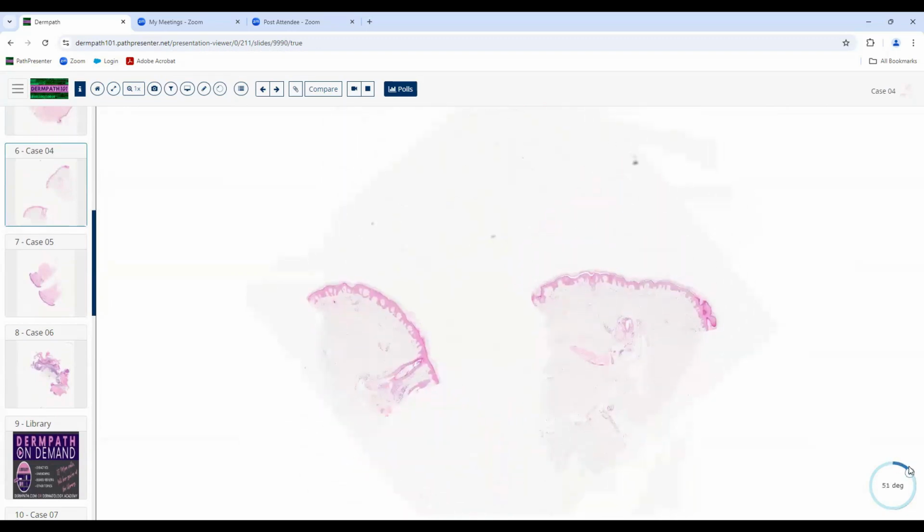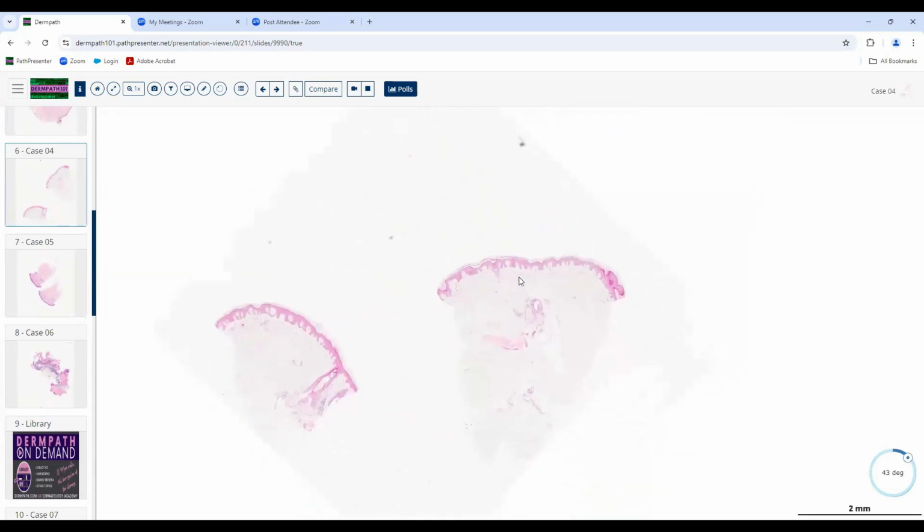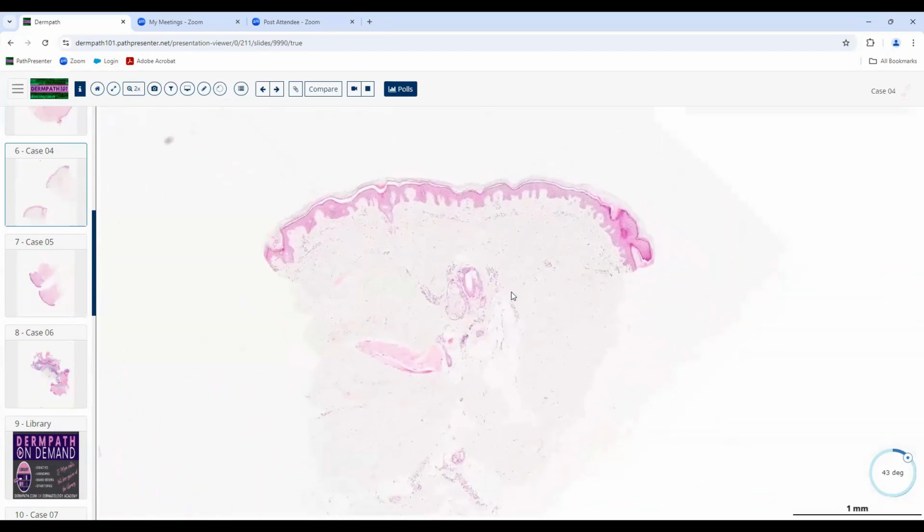This is a good example of this disease, however, and this is probably something that you very well could see on the board examination. They might ask you a couple of second-order questions about it, with a punch biopsy. You can see it's got acanthosis at low magnification, probably taken from the trunk or the extremities. It's not a completely hairless area, but just one or two hair follicles in here and an arrector pili muscle here. We see the acanthosis, and notice at low magnification that these epidermal rete ridges are expanded, and the dermal papillae look almost like little balloons, if you will. They're expanded.